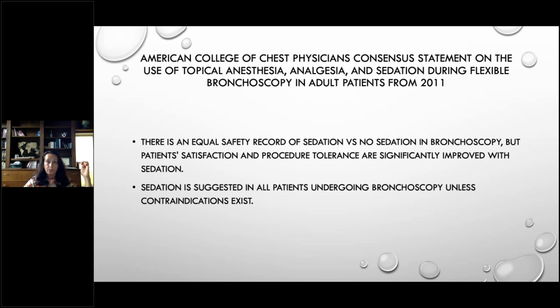So because of that, American College of Chest Physicians, their consensus statement on use of topical anesthesia for bronchoscopy from 2011 states that even though there is an equal safety record of sedation versus no sedation for bronchoscopy, the patient satisfaction and the tolerance of the procedure is markedly improved by sedation. So sedation is suggested and is recommended for all patients undergoing bronchoscopy unless there is a contraindication.